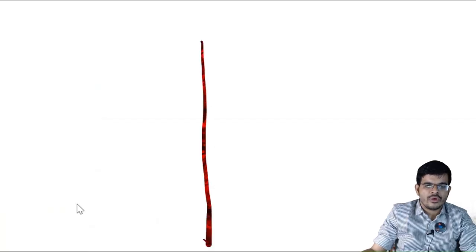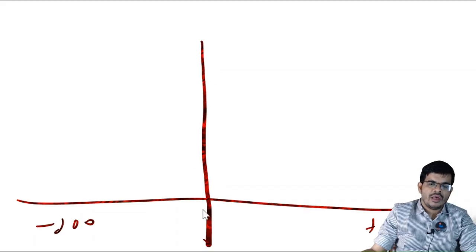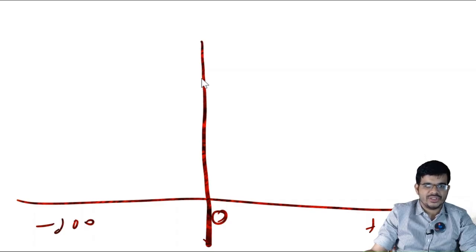Here you have the plus 200 and minus 200. This is the pressure, and we will be trying to increase and decrease the pressure. When the pressure is normal, it has maximum compliance. So we are plotting the compliance of the tympanic membrane against these pressure changes.